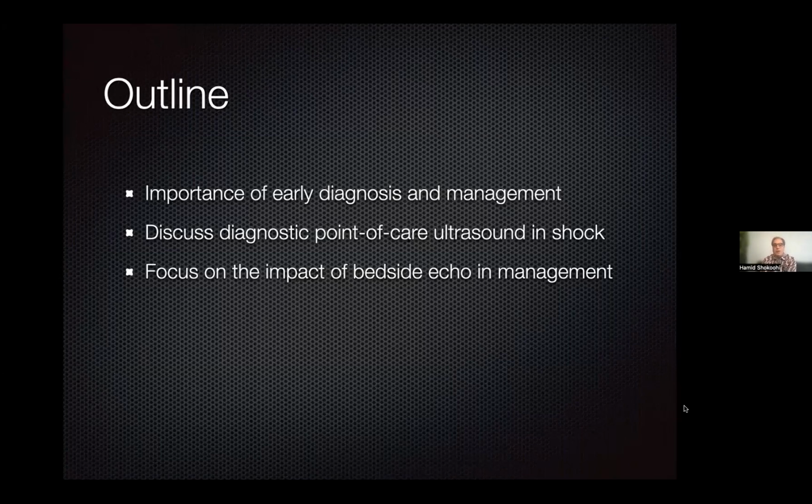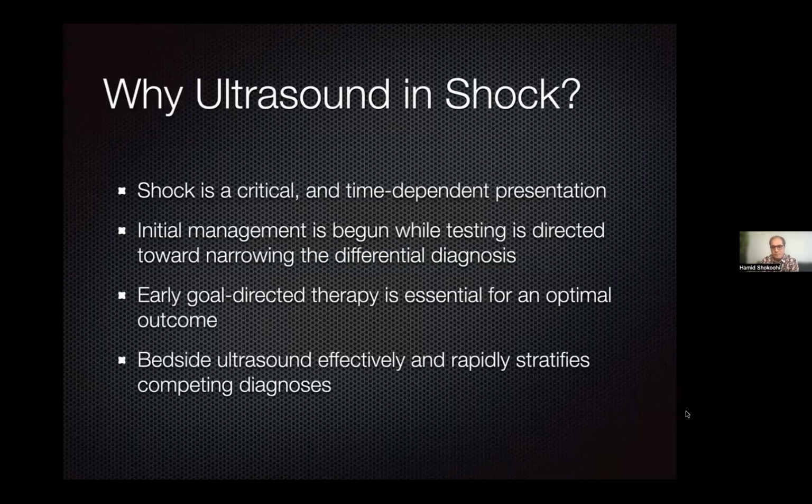For a patient in shock, even if you have a CT scan, MRI, or echo, you have no time, and you cannot send the patient out of the emergency room to do any of those tests. That makes it more important to learn how to put this into the equation and integrate it in your clinical practice. So this is very critical.